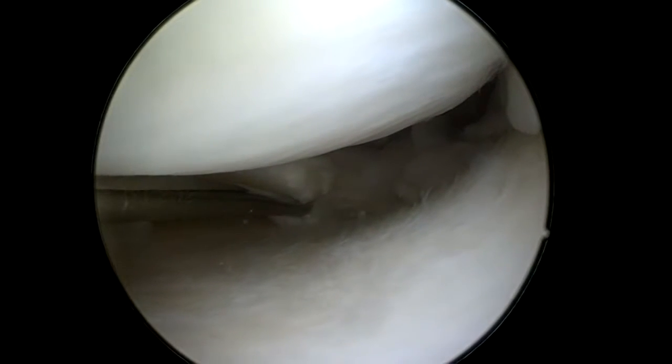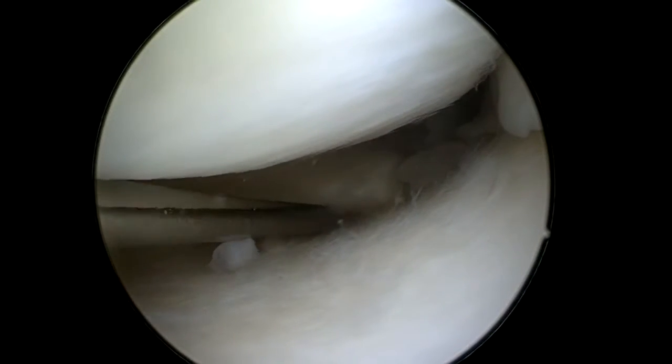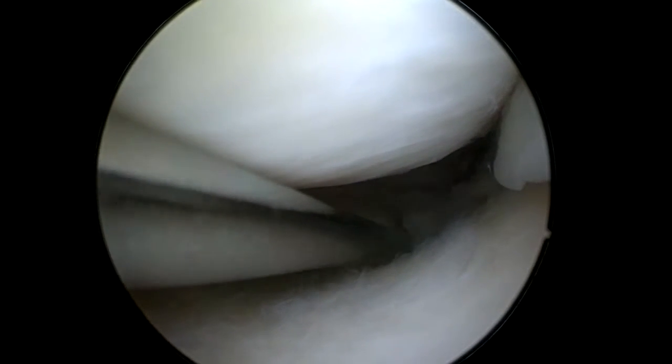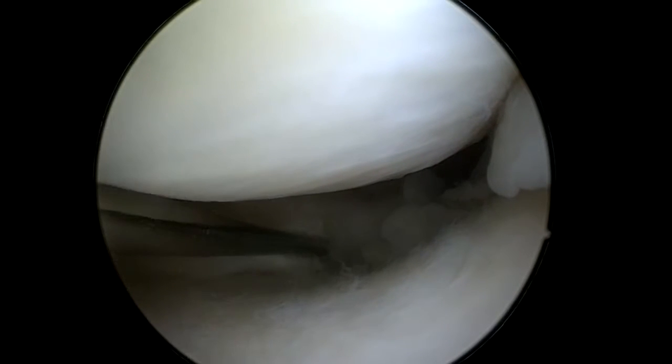Here is the intra-articular view. I put the scope into the joint and with a probe I can see that the root has been torn from the tibia plateau.